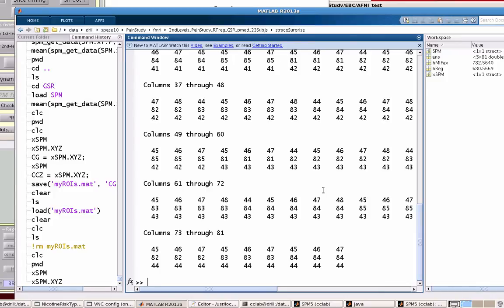This gives a single coordinate for every single voxel in that ROI. And what I can do is assign that to a variable. So CG equals XSPM.xyz.